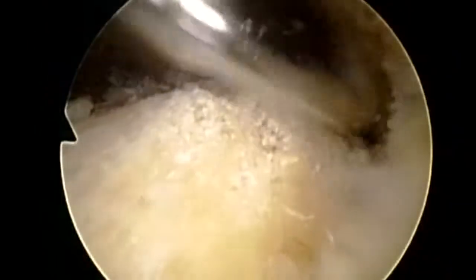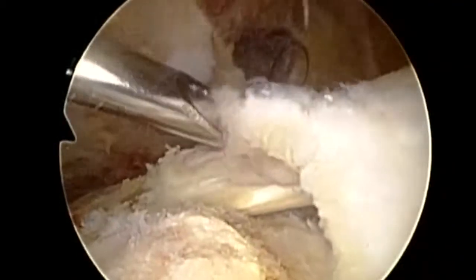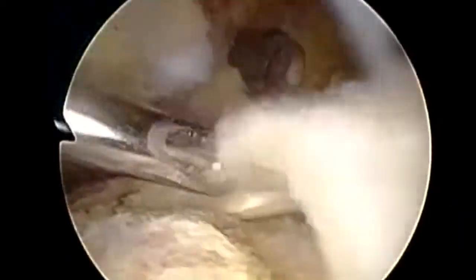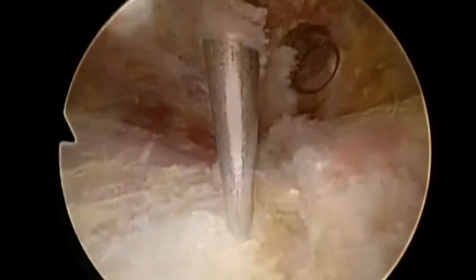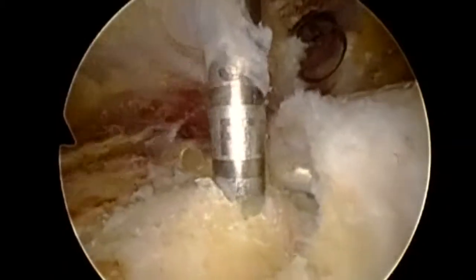We want to get healthy bleeding cancellous bone and take away all degenerated tissue in order to optimize the biologic healing of the rotator cuff repair. What you see here is us debriding the end of the torn rotator cuff to healthy tissue, and then we're using a tendon grasper here to assess the mobility. You can see the rotator cuff tear here looks very mobile, so we can proceed with repair.